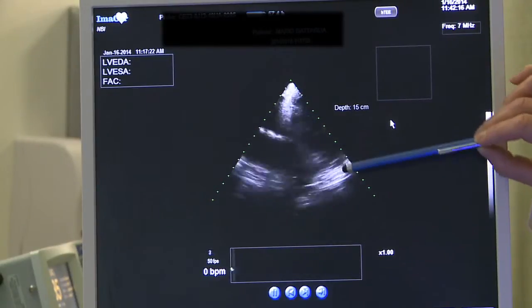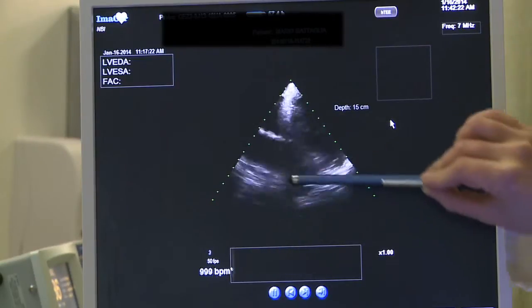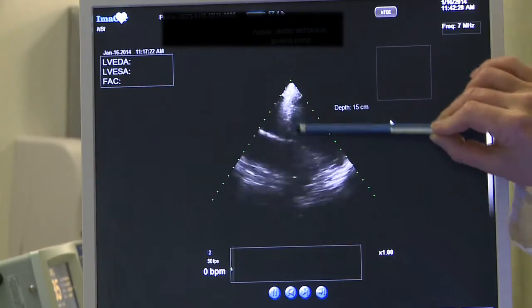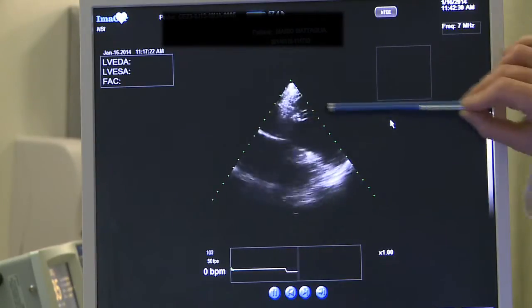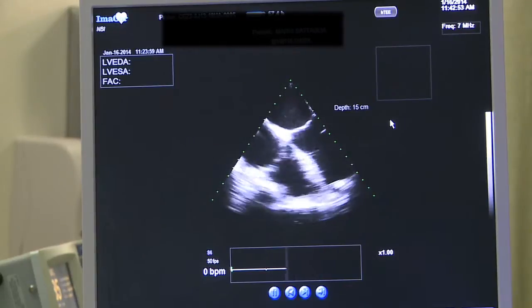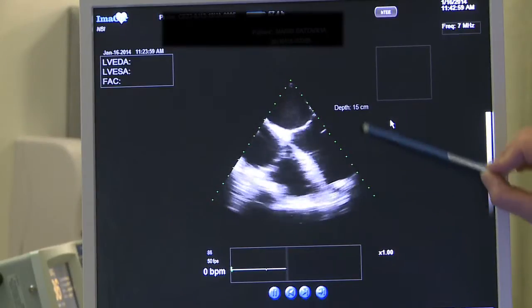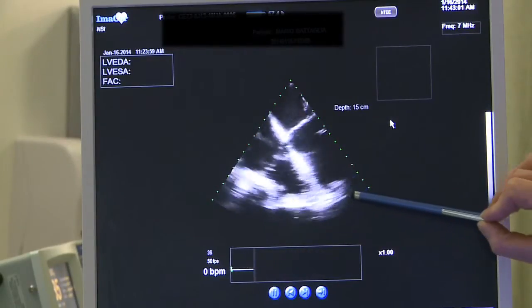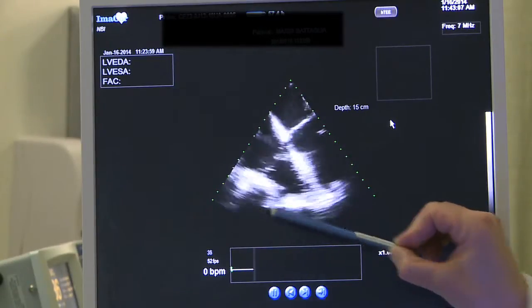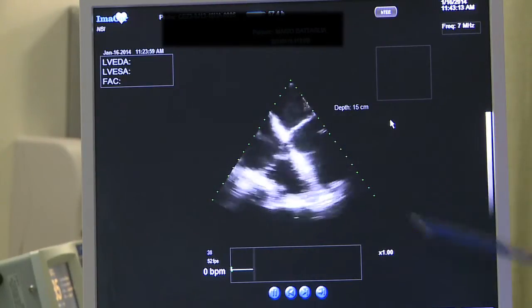I am withdrawing from the stomach. I am at the junction between the stomach and the esophagus. You see the interventricular septum and the right ventricle, which is dilated. He is home-dependent on milrinone. You see part of the AICD and part of the Swan-Ganz catheter, and the mitral valve. We can notice that the interventricular septum is in the middle. This is a modified four-chamber view. We see the right ventricle, left ventricle. I am focusing on the inflow cannula, which is closer to the septum. You can see part of the outflow cannula, the tricuspid valve, mitral valve, interventricular septum in the middle, and interatrial septum in the middle.